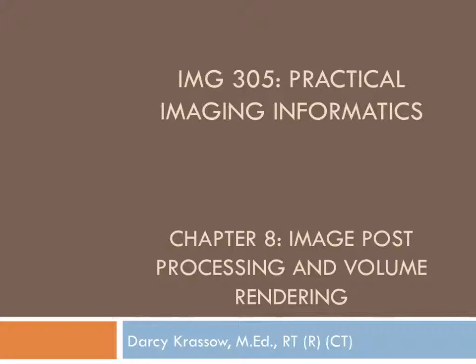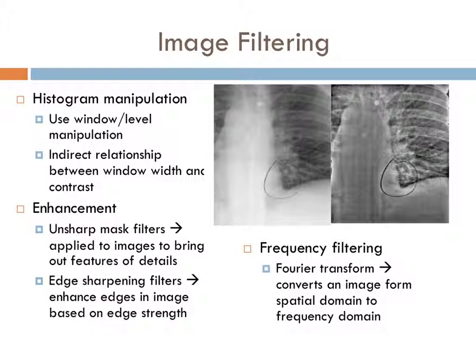These types of processing are done primarily to make the images more visually pleasing, but another use for post-processing is to improve the performance of the CAD algorithms, like I mentioned with the mammography exams. So we'll start with some image filtering techniques.